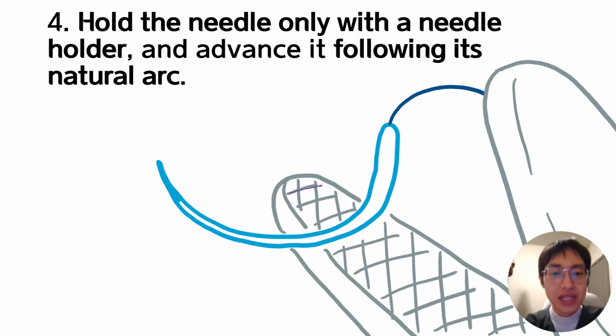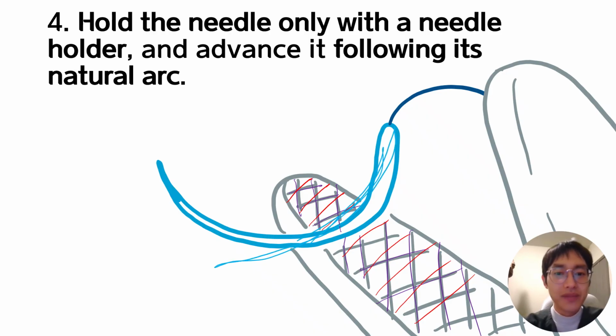As you can see, the needle holder has this cross diagonal grip, okay, that enables you to hold the needle at various angles. But the hemostat, as you know, has only a single straight grip, so you can only hold the needle in a perpendicular way, right?